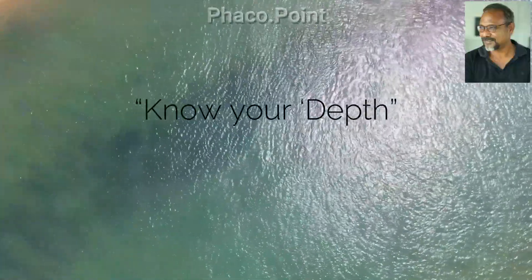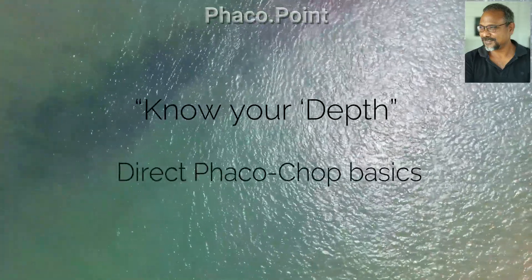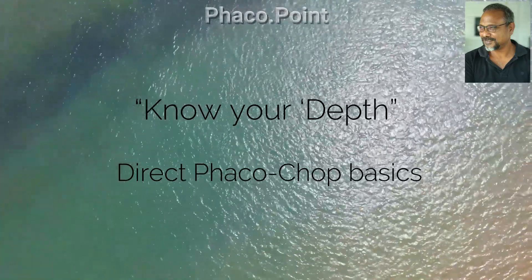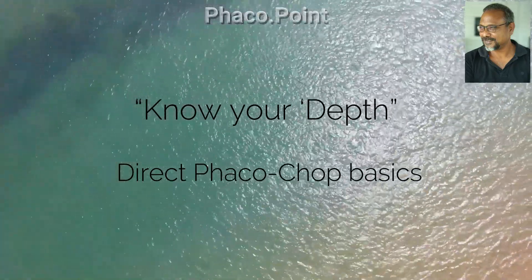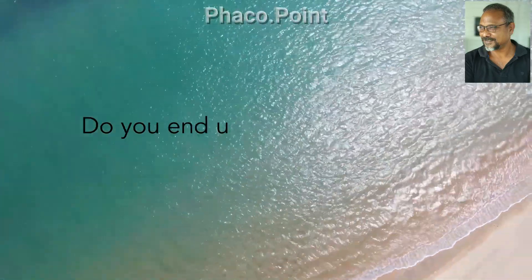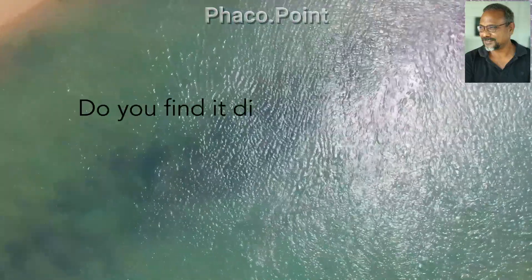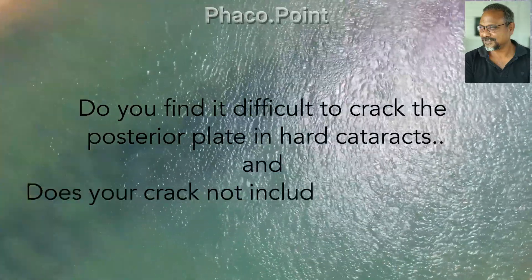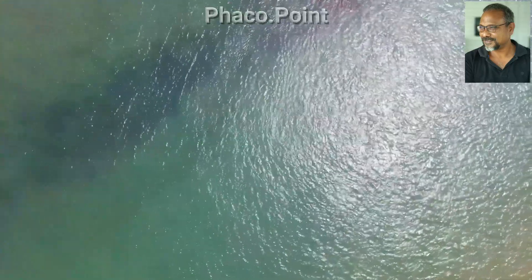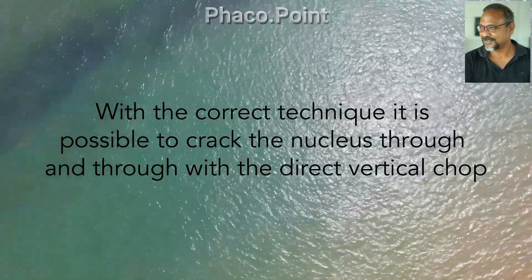This video is made with the intention of helping the novice phaco surgeon achieve a good hold, crack, and separation while performing the direct vertical chop. Let's look at some troubleshooting: do you find it easy to chop a grade 2 nucleus but not a grade 4 chaotic cataract? Do you end up with uneven size phaco fragments? Does the crack not include the amorphous core? With the correct technique, it is possible to crack the nucleus through and through with the direct vertical chop.